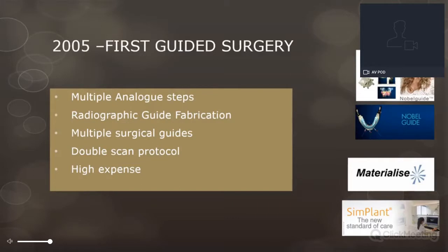There was a stage of outsourced radiographic guide fabrication as well, with multiple surgical guides required for placing the implant, and a double scan protocol with a CT scanner, as well as a very high expense. Let's have a look at an example.